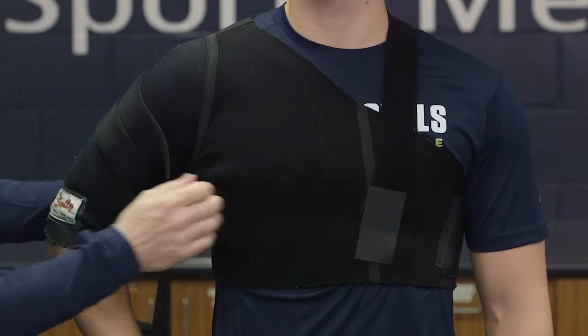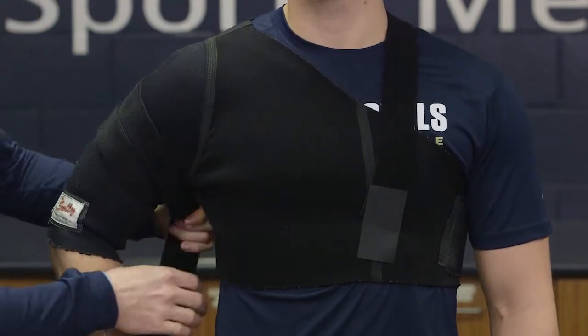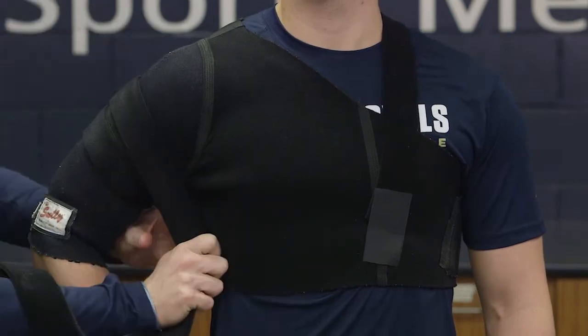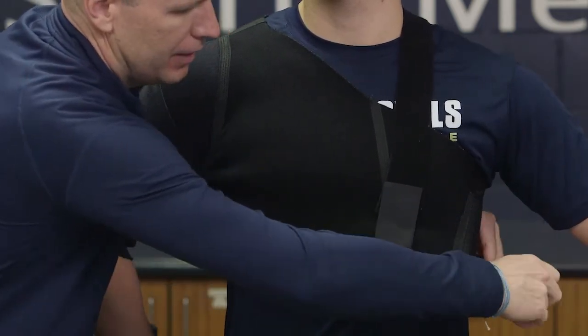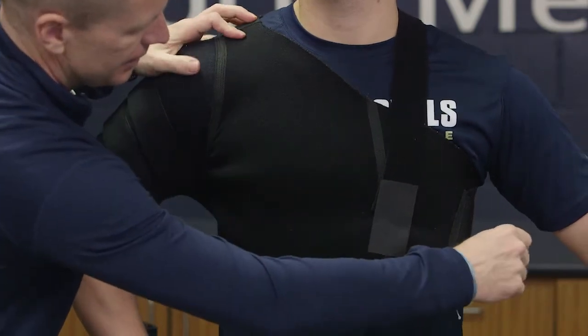We take the other strap and secure it around again, but instead we come around the back and secure it onto the side.